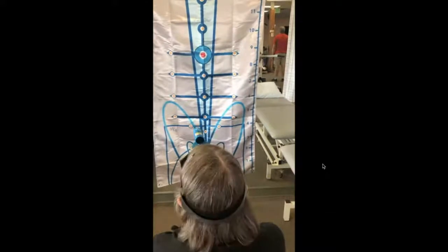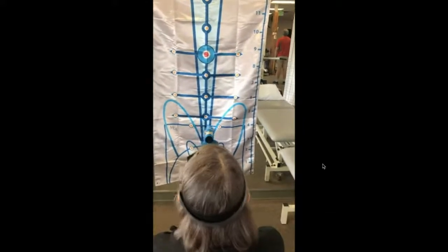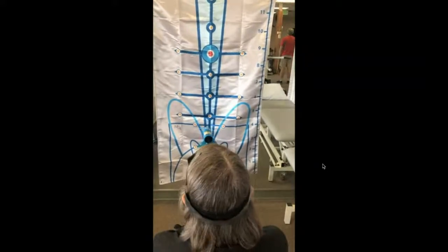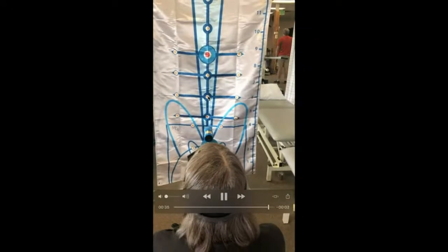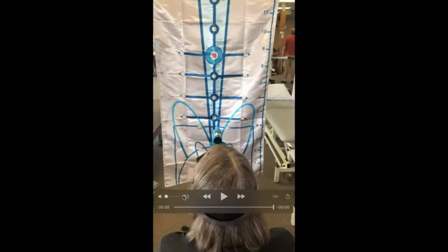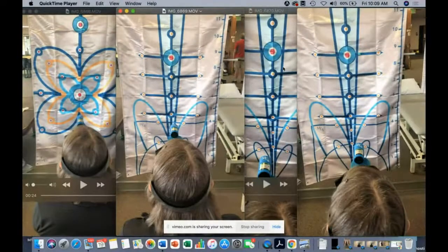But it gives her a quantification of how far she needs to go in order to have equal motion of her VOR right versus left while still having a center gaze. And once again, her center gaze is down and through this area of the second orange target. All right. And these are practice runs. On a scale of 0 to 10, if we want to take like a VOMS type of score, she reports she feels a 7 out of 10 dizziness on that particular scale during that.